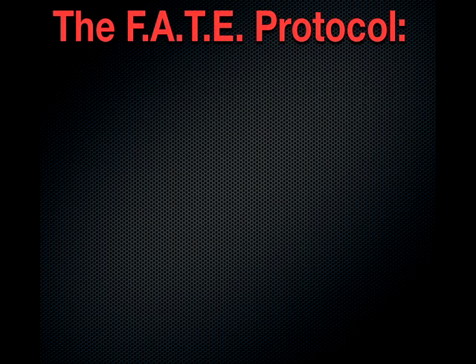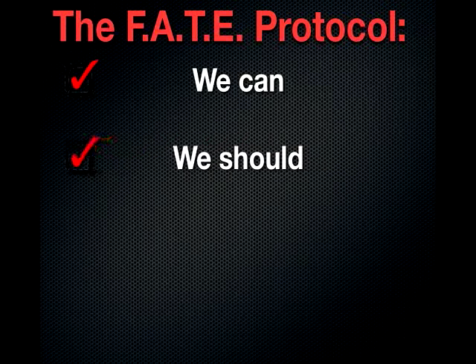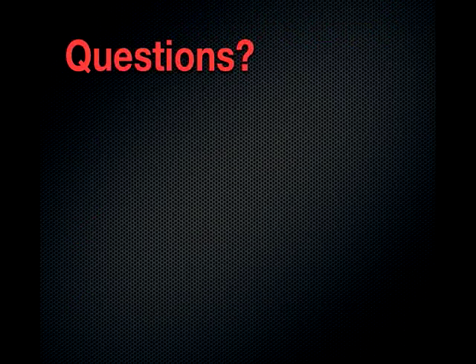So the FATE protocol, to reiterate, is fairly easy. We can do it. It's not hard to learn. We should be doing this. All of the critical care consensus statements say that this is no longer optional in the care of very seriously ill patients. I think it's on the boards now. It's considered mandatory in critical care curriculum. And I do believe that once you get comfortable with this, your practice will change. Thank you.